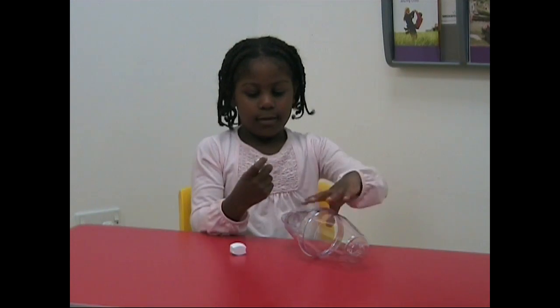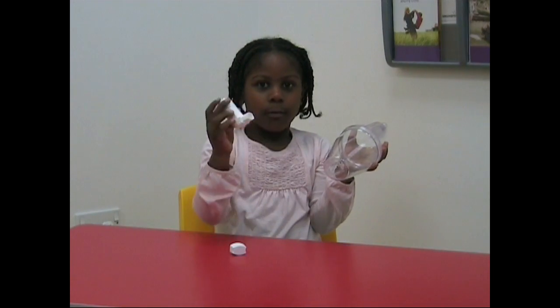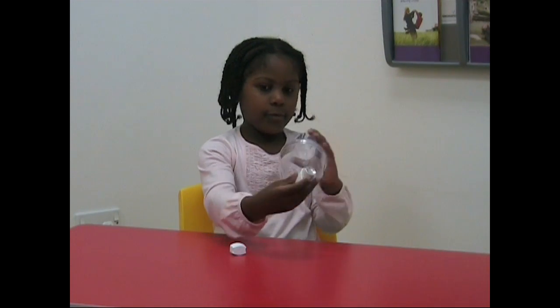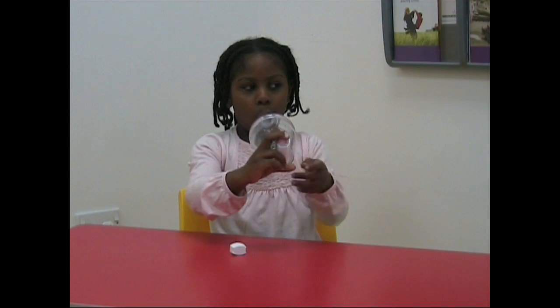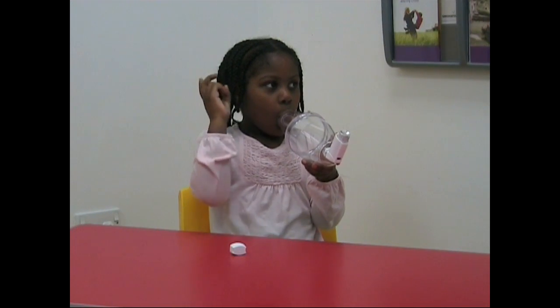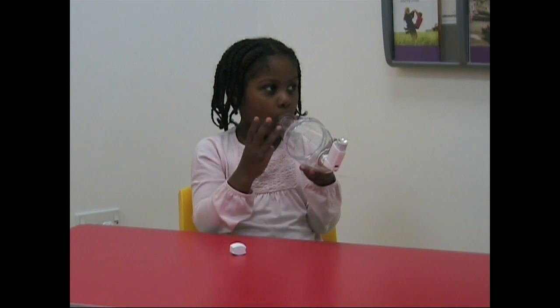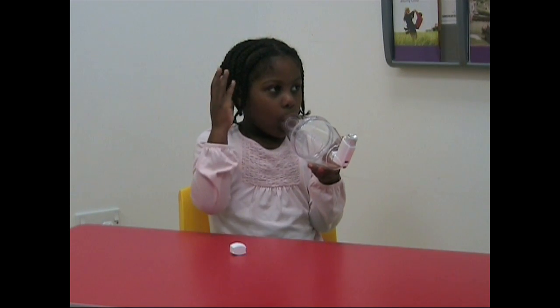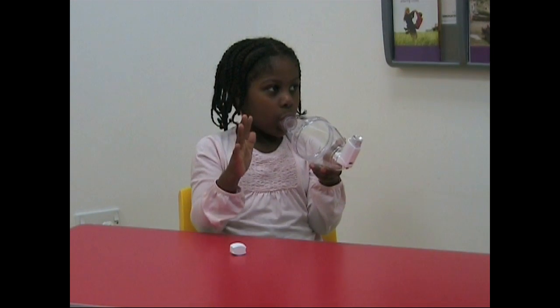And then you shake it and then this tiny hole, put it in here and then blow it when you put it in your mouth. One, two, three, four, five.